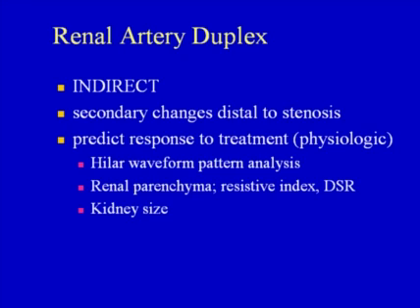Patients have been treated for renovascular hypertension, and although they've improved the vessel wall and removed the lesion, the patient remains hypertensive. So essentially, they have surgical success but a clinical failure. So the newer studies are trying to identify those patients that are amenable to revascularization and have better outcomes.